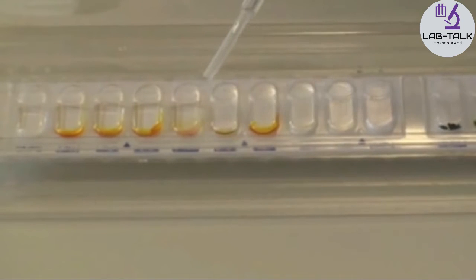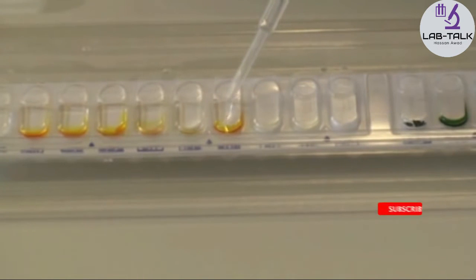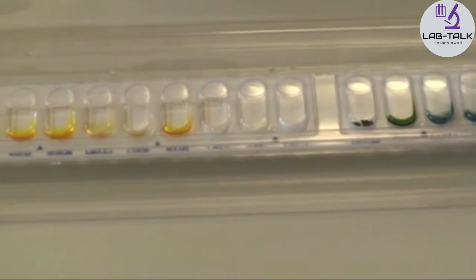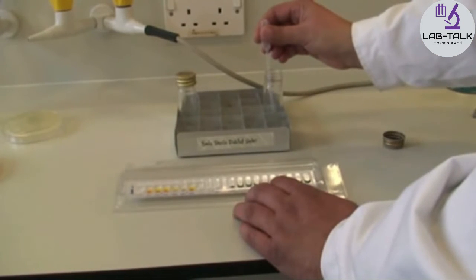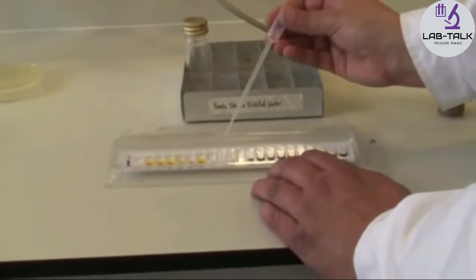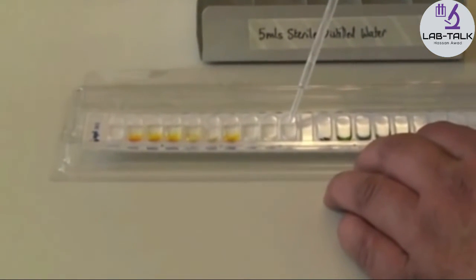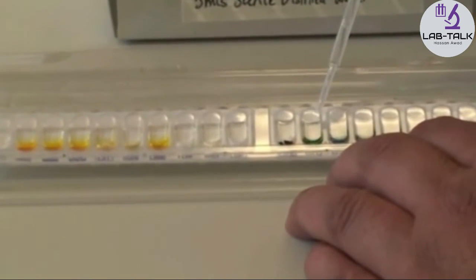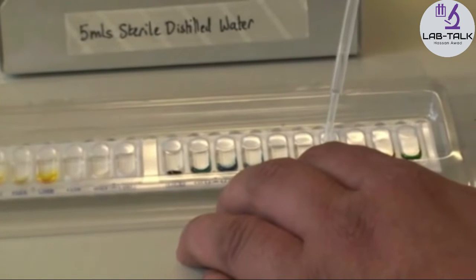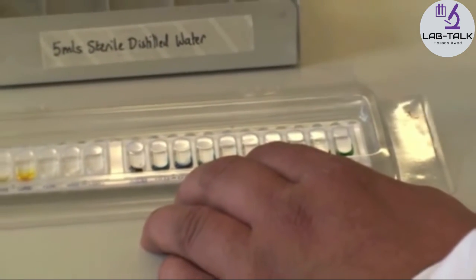Fill with the bacterial suspension only up to that level, all the way across to the very last one. If you run out of suspension, go back and get more into your pipette and fill in the rest of the cupules, starting with indole — always filling in that left-hand corner, which minimizes air bubbles — up until the very last one, arabinose.